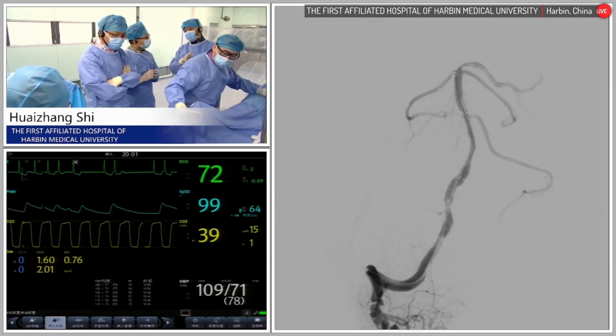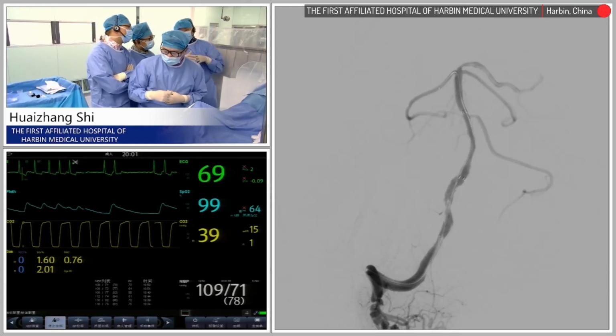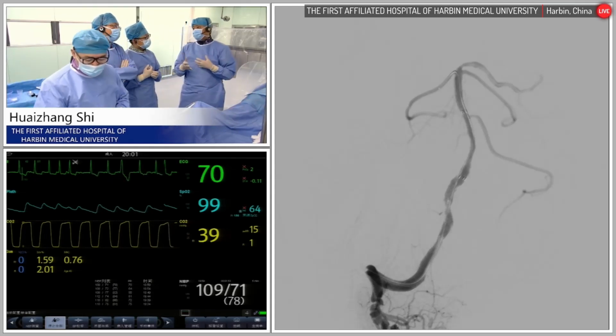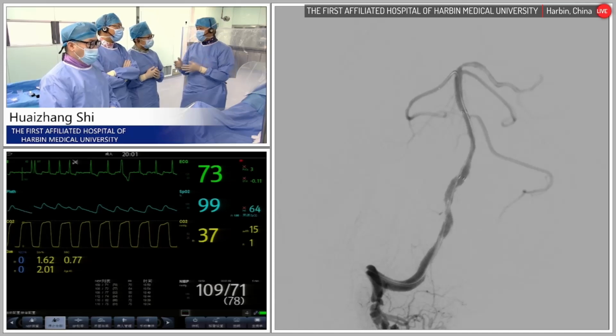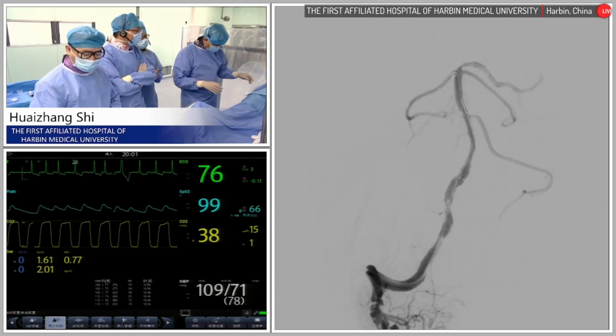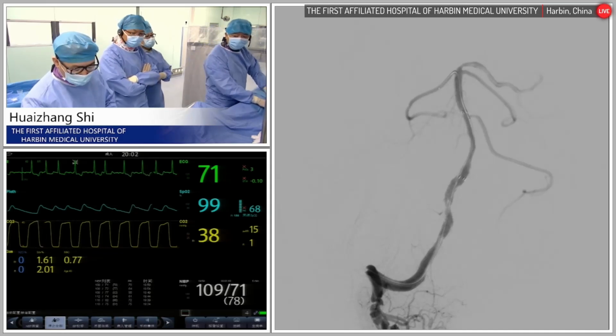But if there is a dissection, like this case, the lesion is very long. I'm worried the long-term result is not good if just the balloon. It's better to put a stent here.